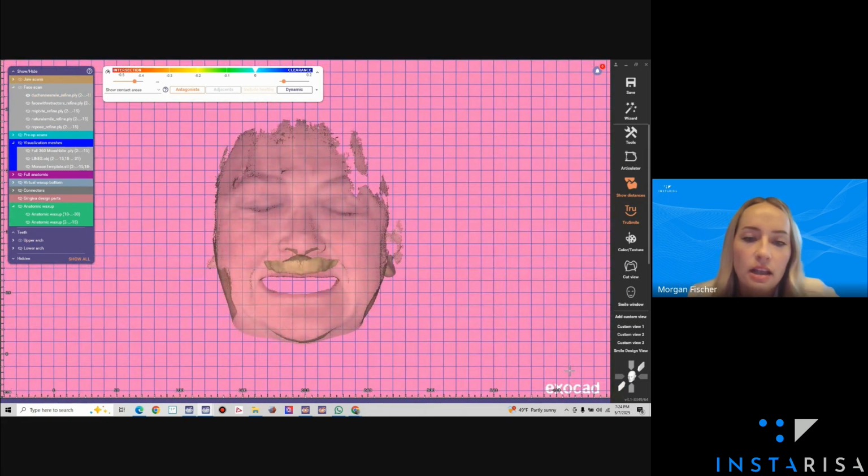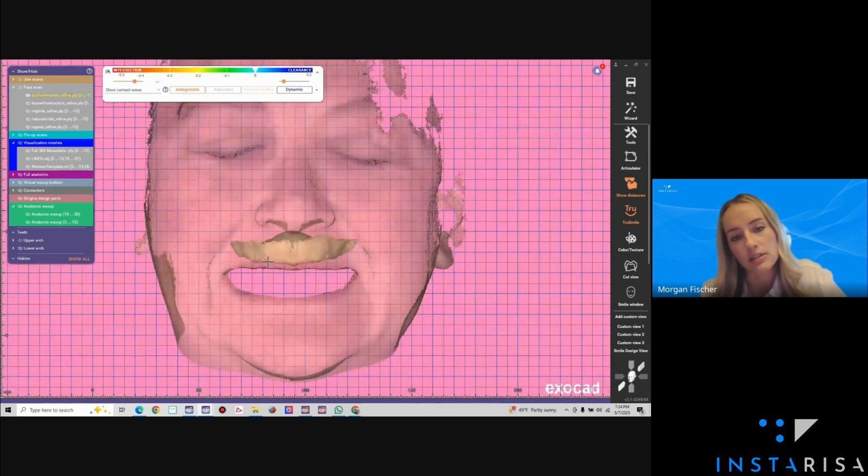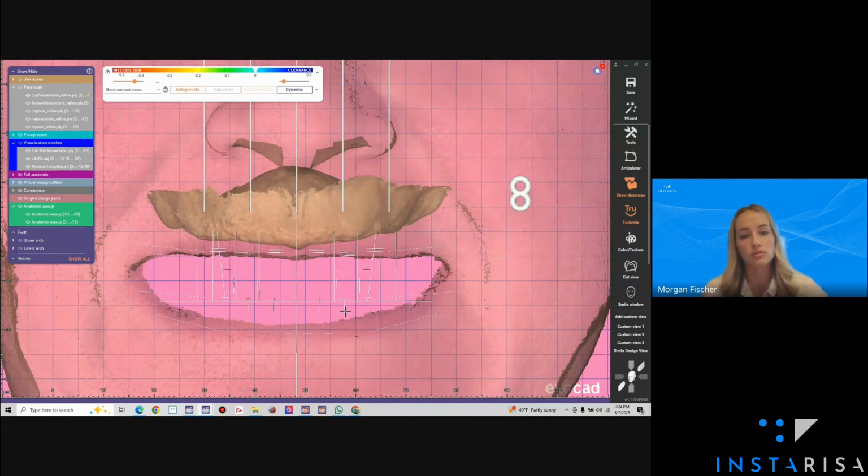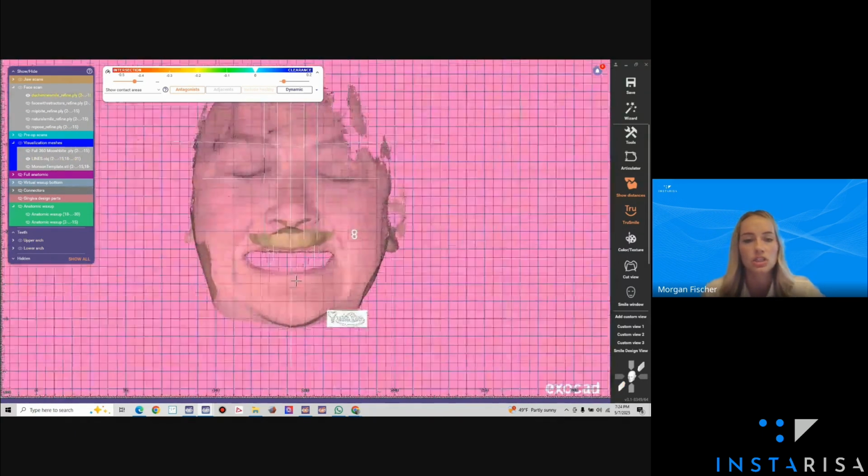I'm sure he's going to go ahead and level the bone out. Dr. Dodgell's an amazing surgeon. I'm sure he's going to level that bone out anyways, so that it's flat with the posterior. But as far as hiding the transition line, she's not at a high aesthetic risk for that. If she were, we would be seeing that communication back with the doctor as far as measurements go, as far as how much to reduce. And then lower is going to be crown and bridge, so we don't need to worry about any reduction there.